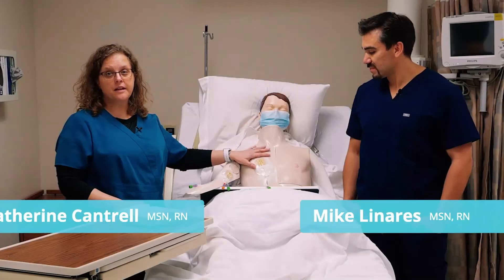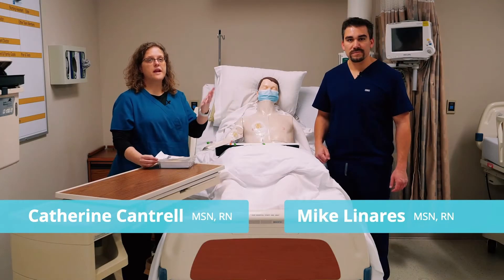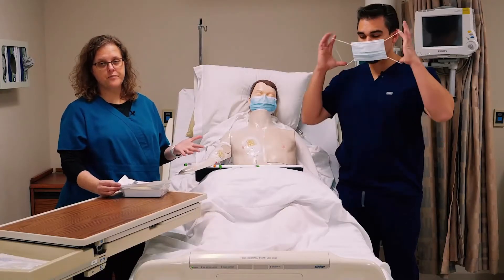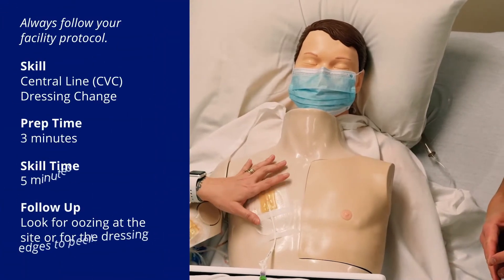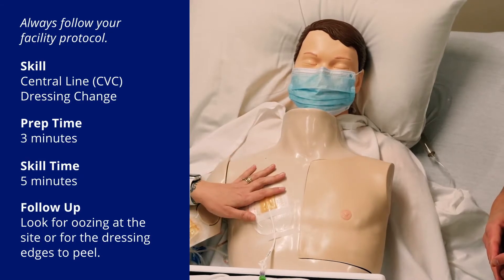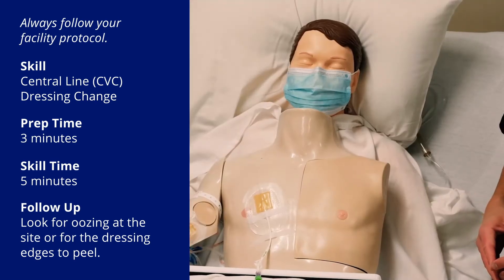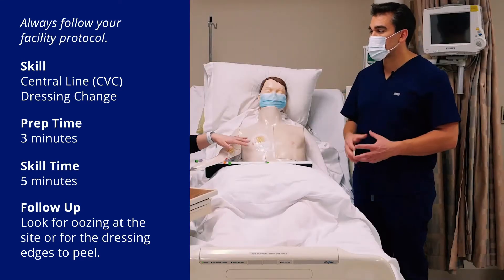We're going to start with the subclavian line. We've already got a mask on the patient, and it's important for anybody in the room to have a mask on while we're changing a central line dressing because it's a sterile procedure. We have a PICC line and a subclavian — we're going to change the subclavian first. The subclavian is usually more temporary; the PICC line can be in for a couple of weeks. Each line has its own parameters for how often you change the dressings.